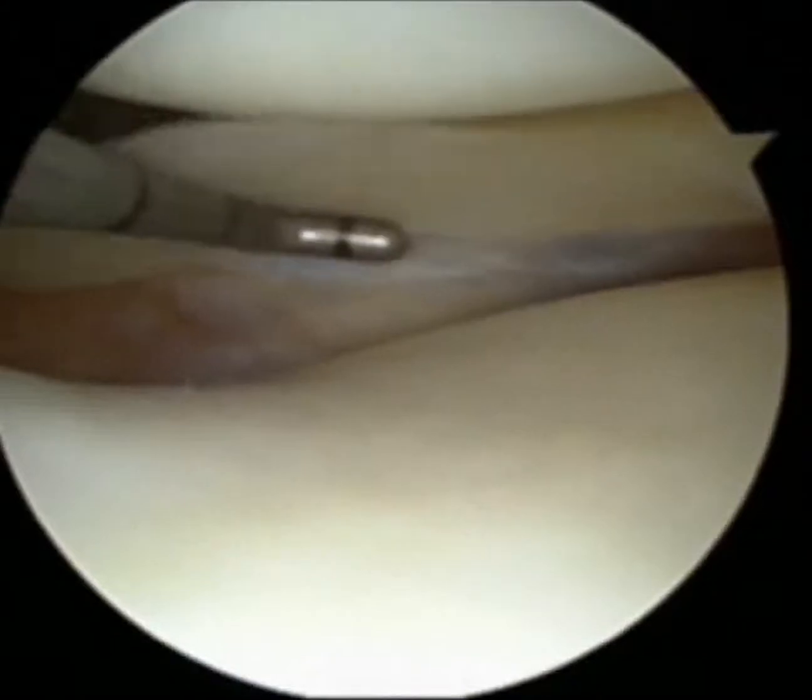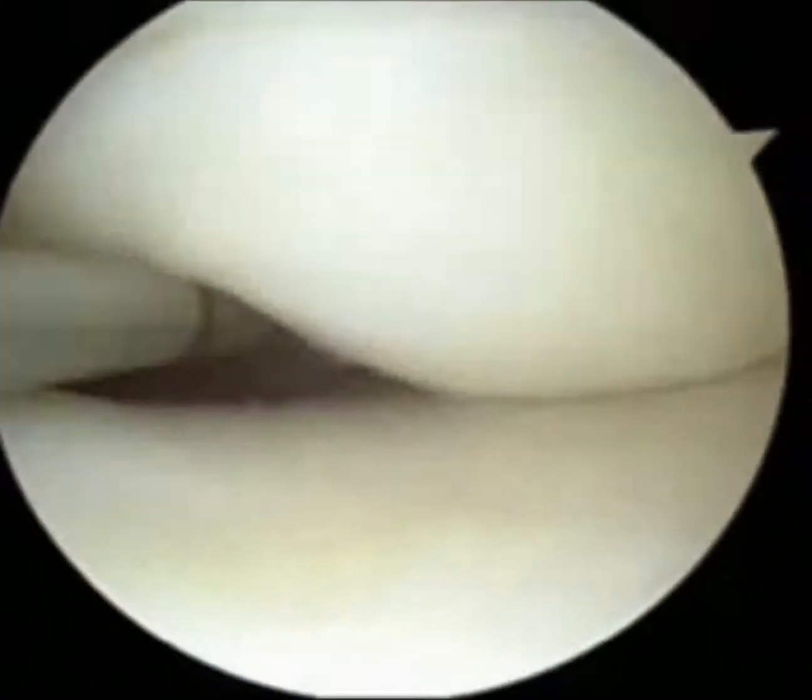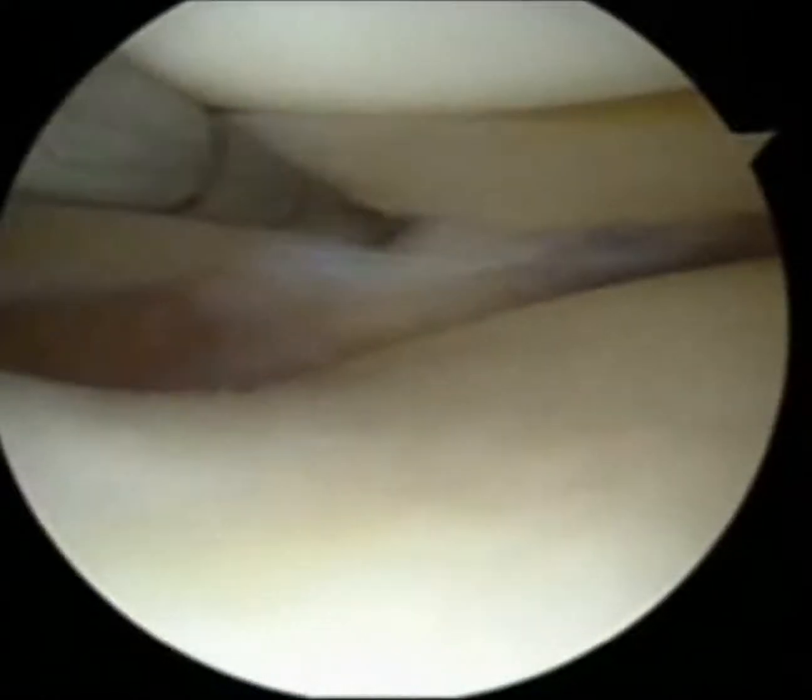Arthroscopic observation and probing into the popliteal meniscal fascicle area would be helpful. Hypermobility of the lateral meniscus can be observed via arthroscopic probing, where the lateral meniscus excurses more than half of the lateral meniscus width.